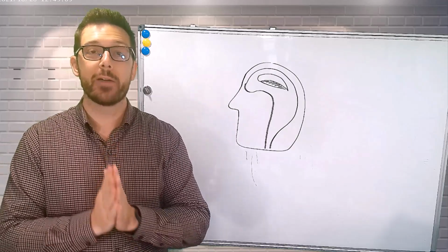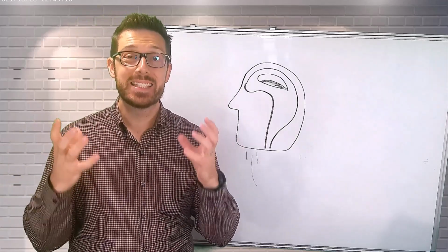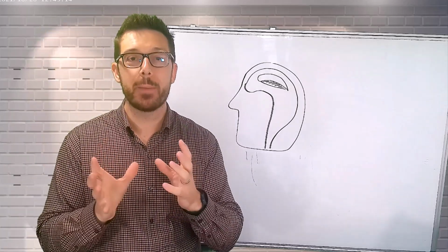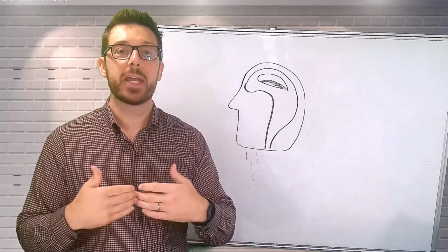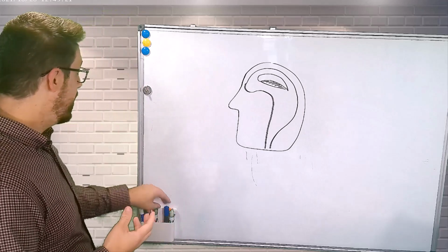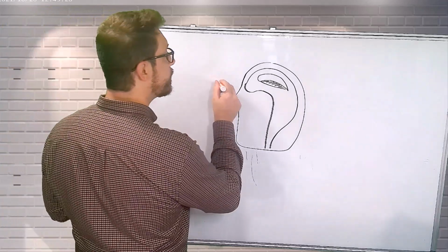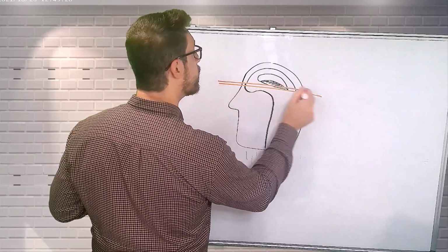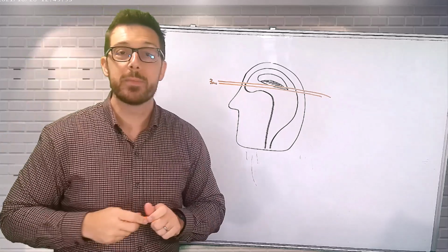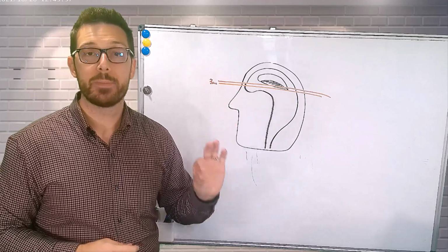Partial volume averaging is an artifact that we see on our image when we use thick slices. In order to understand this artifact, we have to understand what's happening with our slice. Anytime I plan a slice, I have to select a thickness. Let's say I select a 3 millimeter thickness. Essentially what I'm telling the system is I want to capture 3 millimeters of tissue in each slice that I plan.